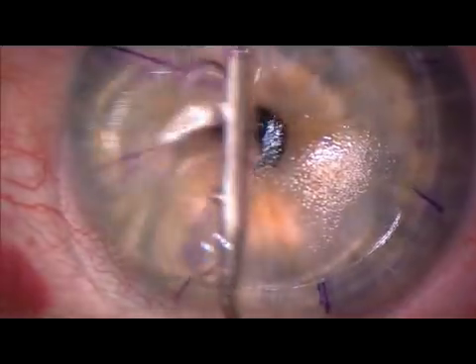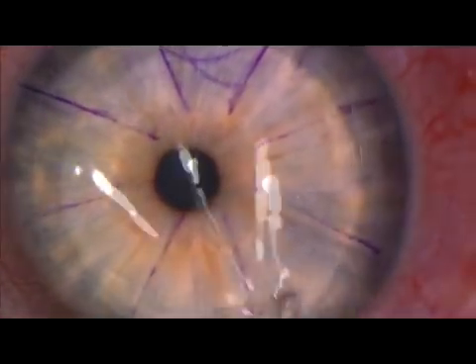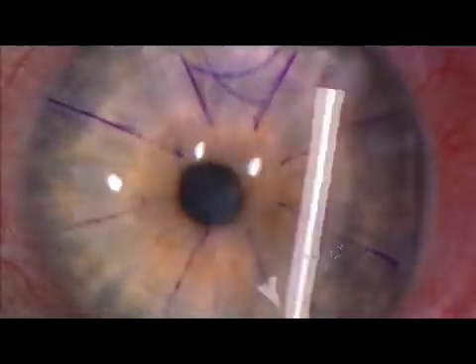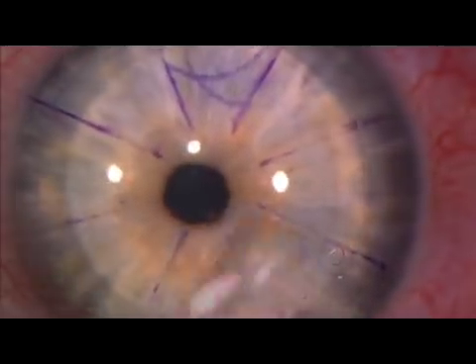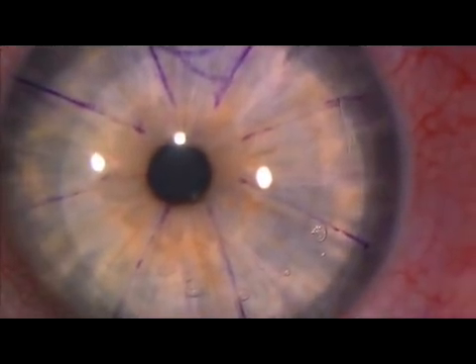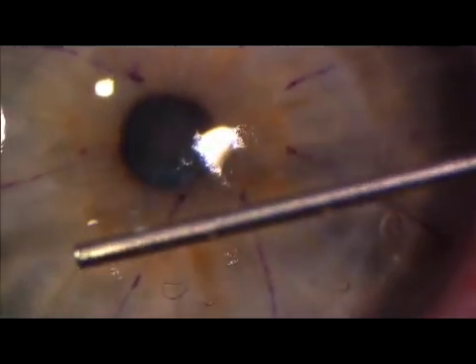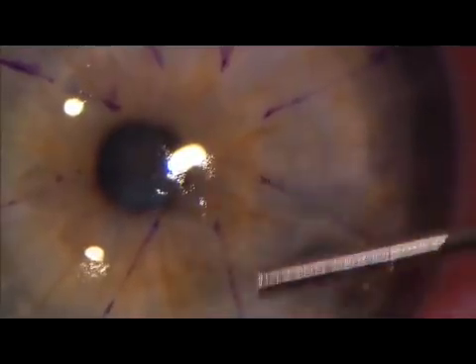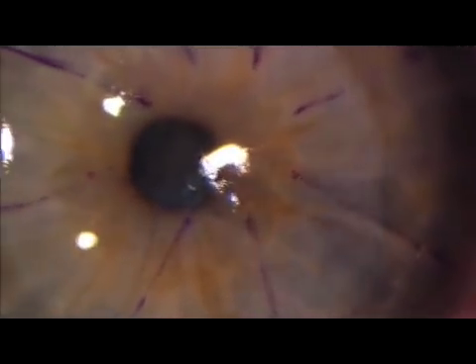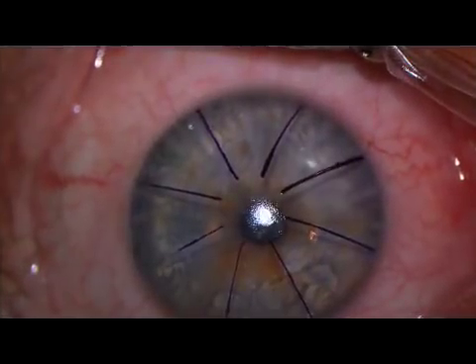I like to float the flap in place and to use the generous markings to ensure an optimal fit. Bubbles can be seen in the interface. Surgery proceeds in a similar fashion for the other eye.